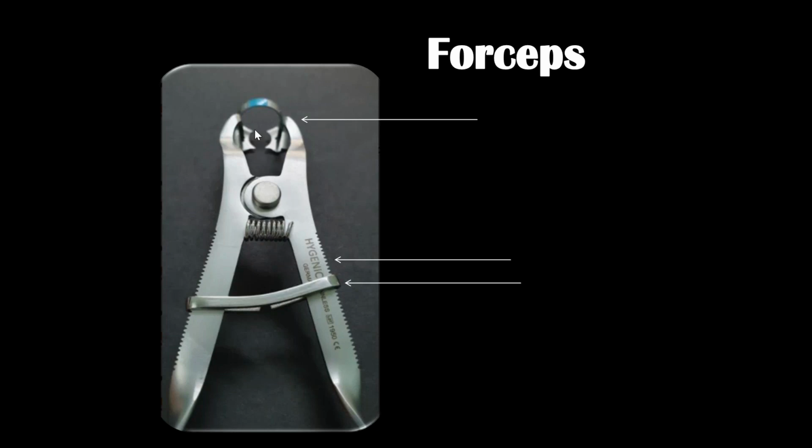It is possible. So many people think that this is the maximum it will expand. It is actually because the ring has engaged the serrations on the clamp and the beaks are gentle. That's the reason you feel that the pressure is too much. It's actually, if the beaks were strong, every clamp would have got widened by the first time users.